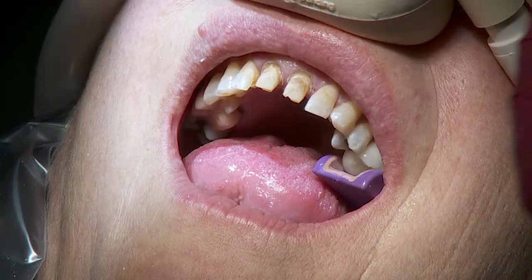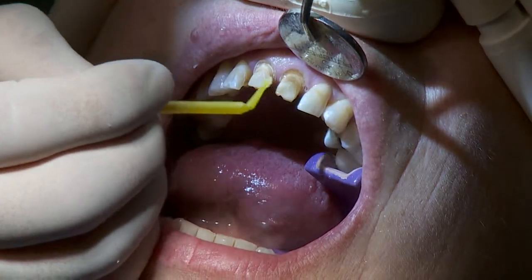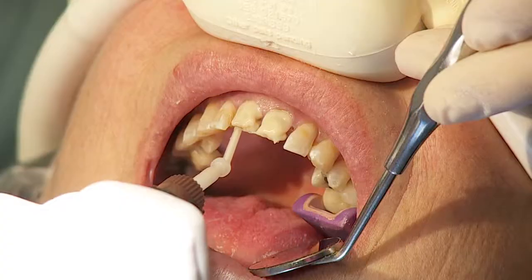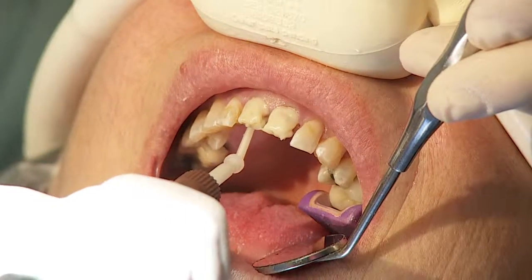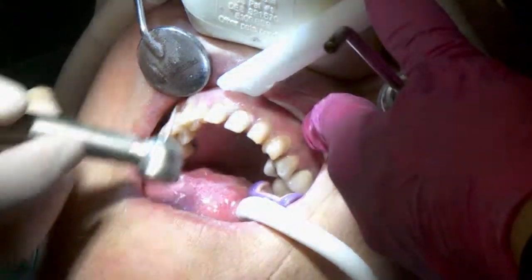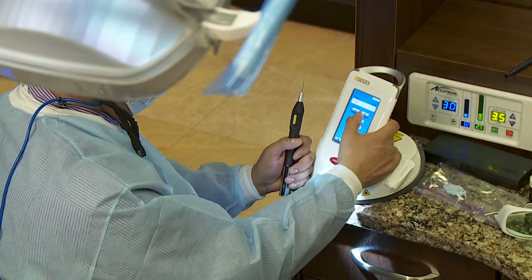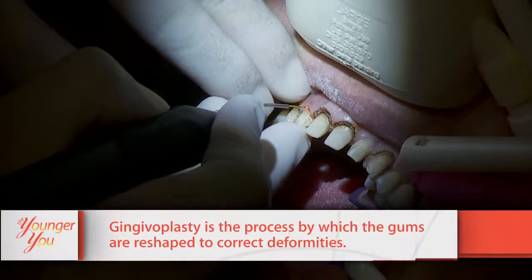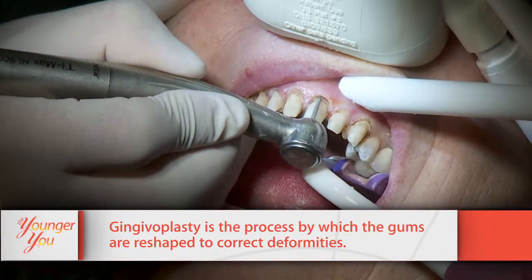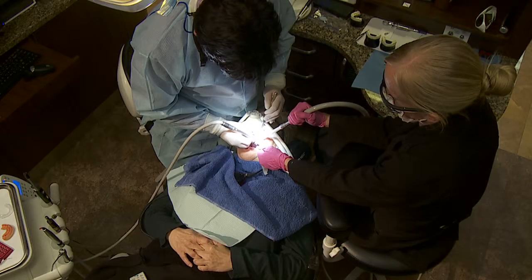I'm going to try to build her teeth out. So what I'm going to do is build them up to give her more strength to the tooth internally. So we use this material that is going to bond to her natural tooth. What I'm planning to do now is I'm going to laser her gums. She tends to have a little bit of a gummy smile, so I plan to minimize the look.